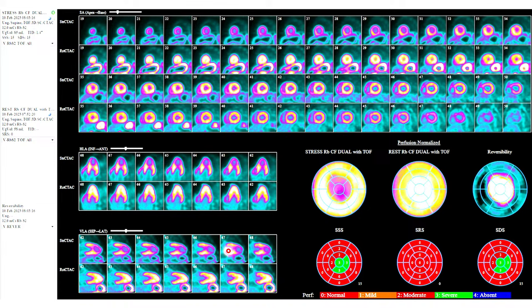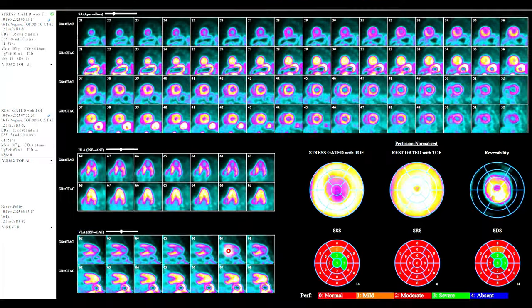Very good. Hold that thought. Let me show you. What do you notice about the thickness of the myocardium? It looks like the apical segments thin out after stress, and at rest they seem pretty thick, so this could be something like apical HCM. Very good, wonderful.